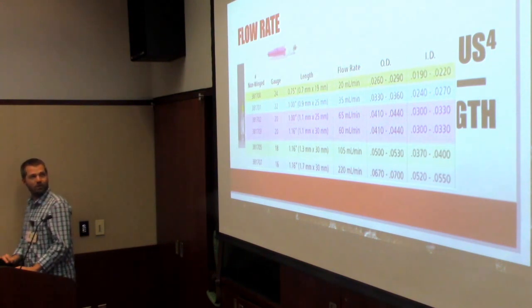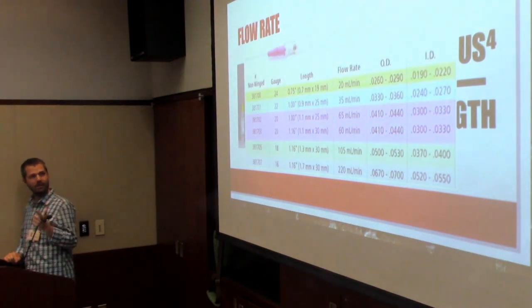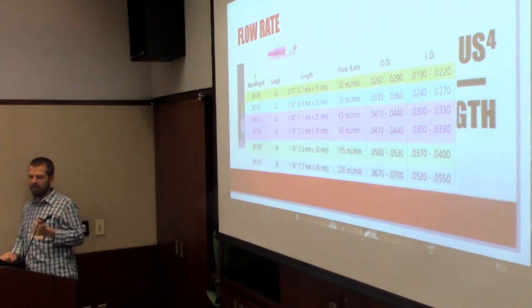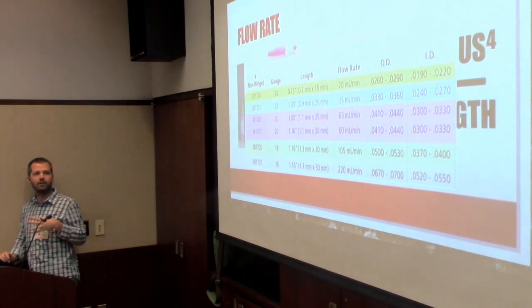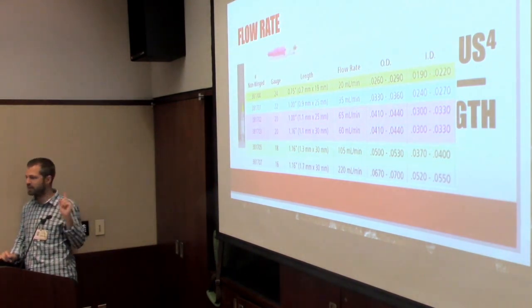So there's this wonderful little chart you can get. It's also written on the back of every IV. And it tells you the gauge, the length, we have the long IVs, and we have the flow rate. A lot of times I thought it was just a fun factoid, like, oh, you can look up the max flow rate you could theoretically do. And I finally figured out why, and to whom, this actually matters.